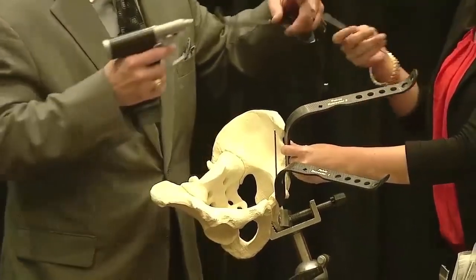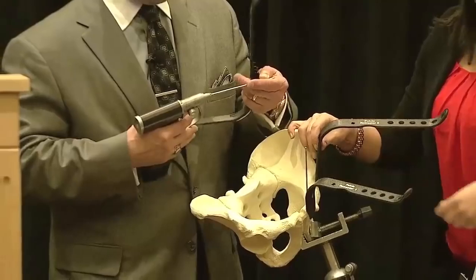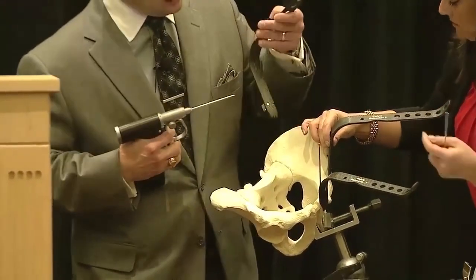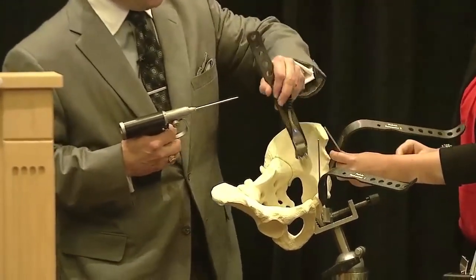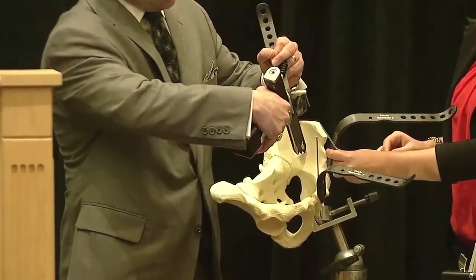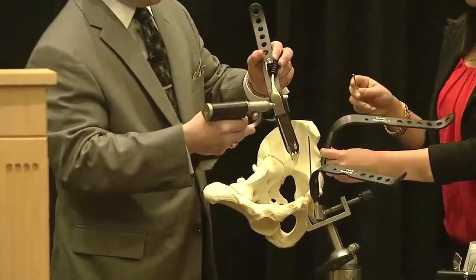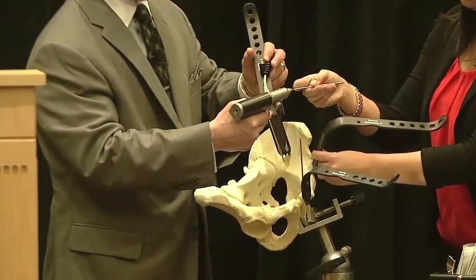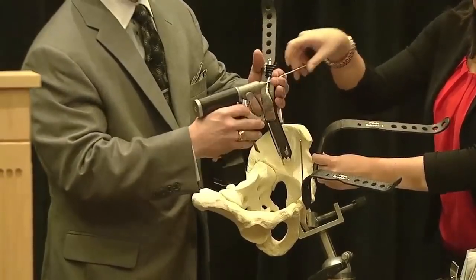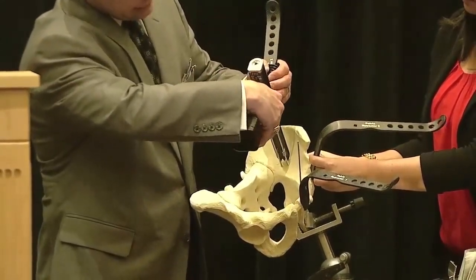The number three retractor, which we call the iliac vessel retractor, is designed to go up in the iliac fossa and retract the iliac vessels and the psoas muscle. We'll assume that this is where we want it, and we'll pin that one in place. Okay, you got another pin, Karen. Thank you very much. There you go. And then we'll bounce over to Dr. Sagi in just one minute.